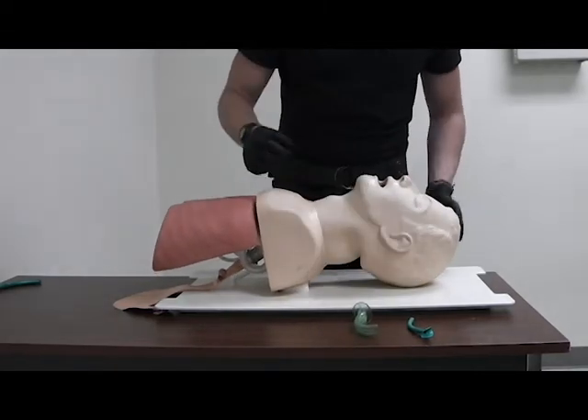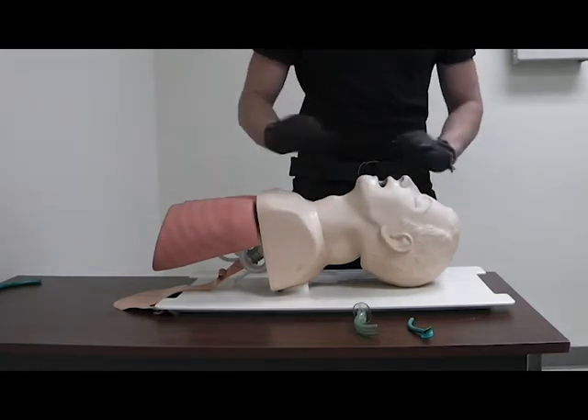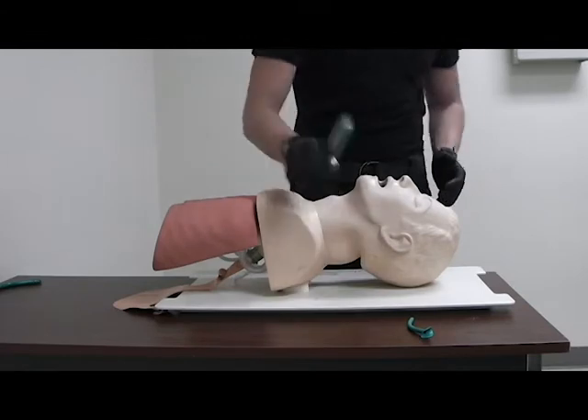Position their airway, and for OPA you want to make sure they don't have a gag reflex. You check this with an eyelash brush test — no flutter means no gag reflex.